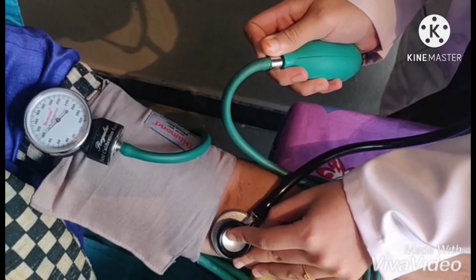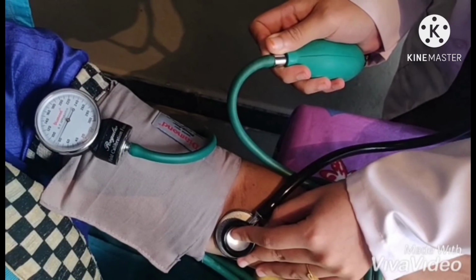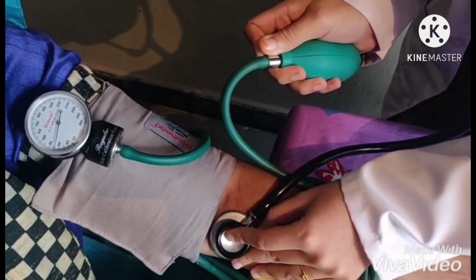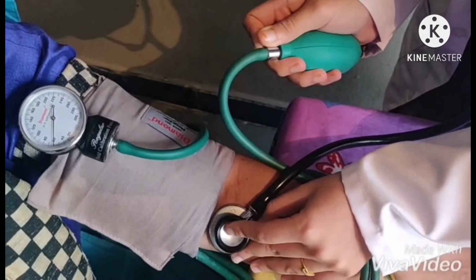For my mother, it is 100 mmHg. And the pressure at which the sound muffles or disappears is the diastolic pressure. For my mother, it is 70 mmHg.